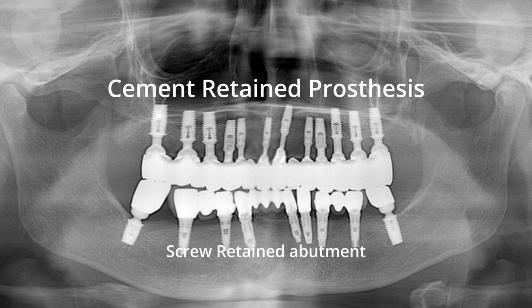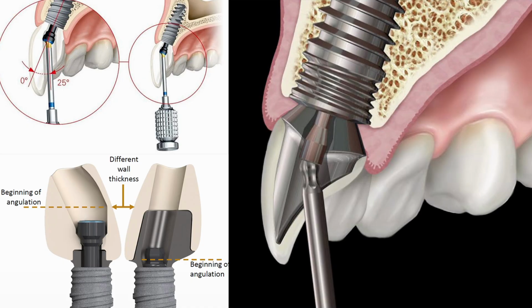Ultimately, by directly connecting prepared stock abutments or custom abutments to the fixtures and taking impressions using the direct technique to fabricate the working cast, accurate prosthetic restorations can be produced. It is essentially the same process as performing full mouth rehabilitation on natural teeth. And if necessary, implant prostheses can be fabricated using the SCRP concept, limited to the posterior region. Of course, screw-retained implant prostheses can be fabricated using angled multi-unit abutments or tie-base or custom abutments with angled screw channels. This approach is technically possible.